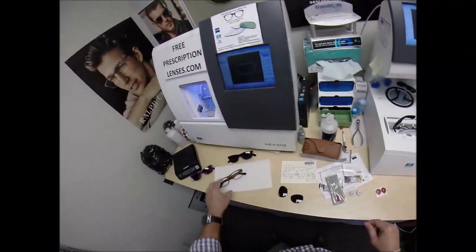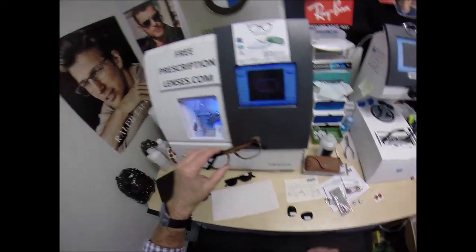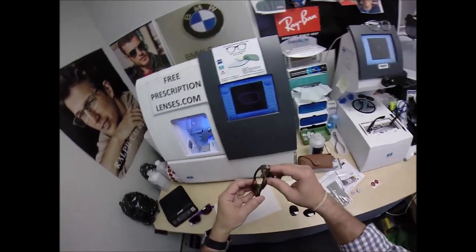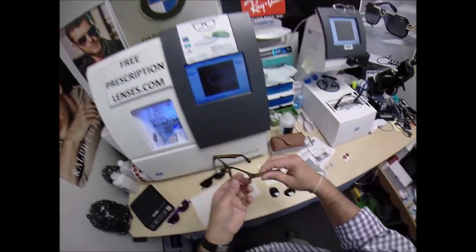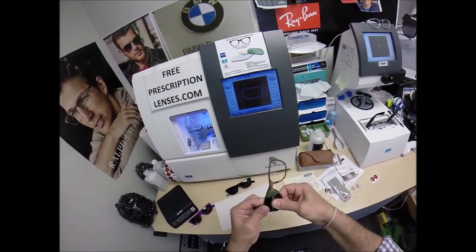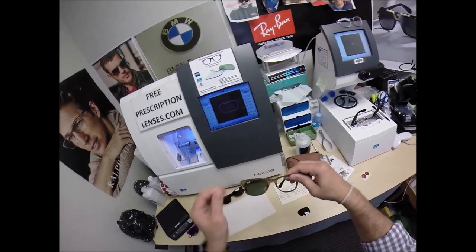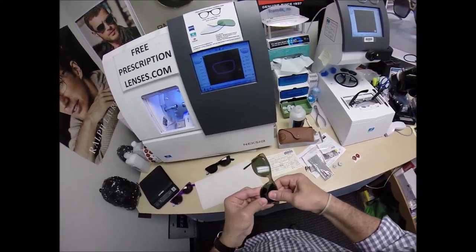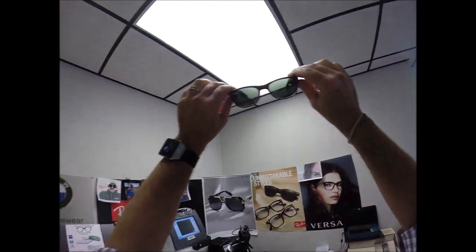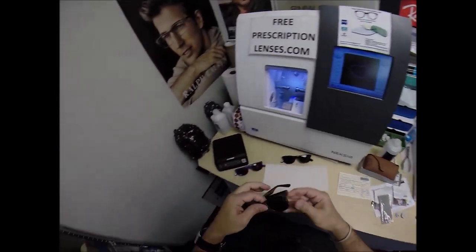You buy any genuine frame I sell — the Ray-Ban 2132, the Christian eyewear John 316 — and you'll receive one free pair of clear, single-vision prescription lenses or non-prescription fashion lenses. I'm going to take your original glass Ray-Ban lenses that you will be receiving, pop them into the frame. That snaps in there perfectly — if I hold it up to the light, there are no gaps whatsoever.